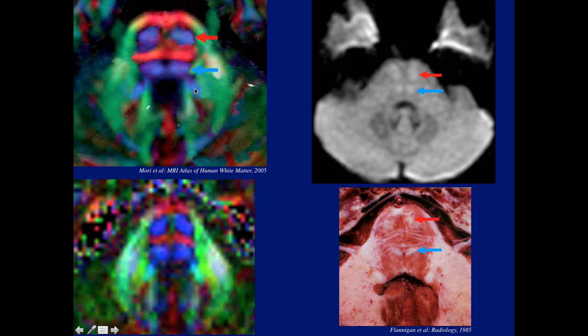On DTI, the corticospinal tract is anteriorly in blue because of the superior-inferior direction, in red were the crossing corticopontocerebellar fibers, the middle cerebellar peduncle in green because of the anterior-posterior direction, and the superior and inferior cerebellar peduncles. The last missing item: these are the medial lemnisci for proprioception and the various other sensory fibers. Everything on DTI can be identified.